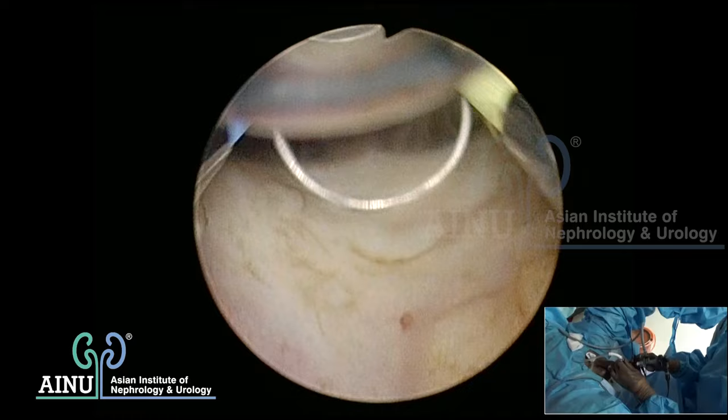The middle lobe is taken away - this eases the flow into the bladder significantly. Now we proceed to resection of the lateral lobes. This is the median commissure and these are the lateral lobes. If you are a beginner, always mark where you have to end. I'll show you again after emptying. I am just emptying to make the vision clear, nothing more.